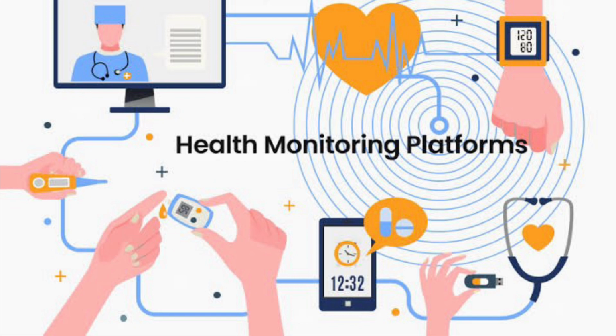The fourth step is to identify and recruit eligible patients. So this one should be done with care. First of all, in the initial step, we have identified what is the need for that. For example, if you are going to recruit only patients in the immediate post-intensive care, or patients who need monitoring immediately after surgery or after a head injury or in the emergency, one should identify that group of patients and they should be recruited into undergoing continuous monitoring.